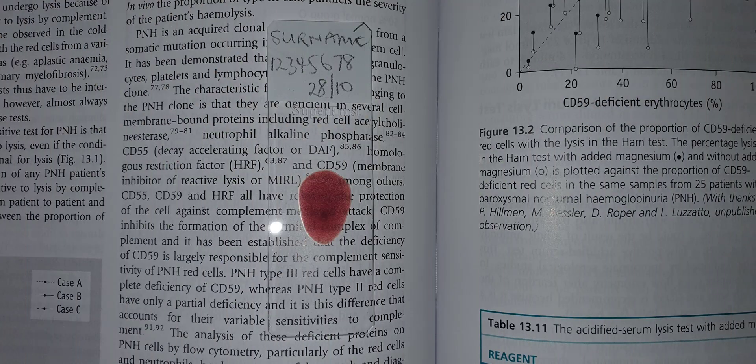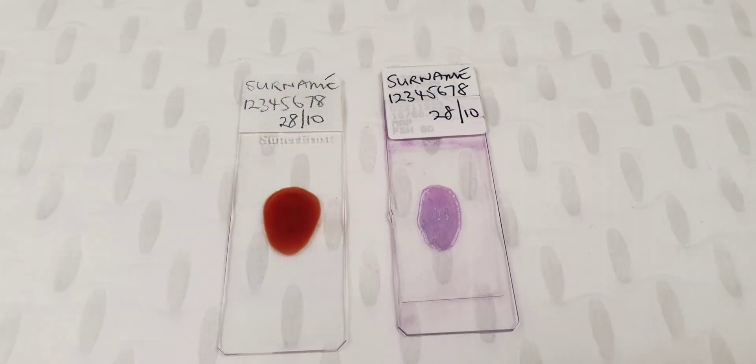If the film is of the correct thickness, you should just be able to read newsprint through the stain. You should examine a thick film for at least 5 minutes before you declare it negative and no parasites are seen.